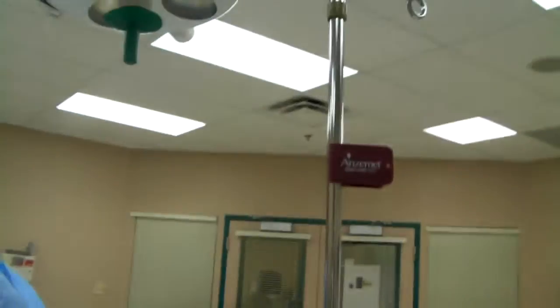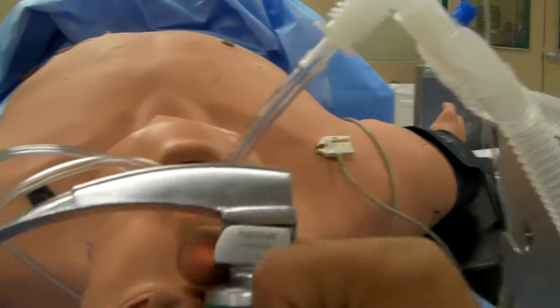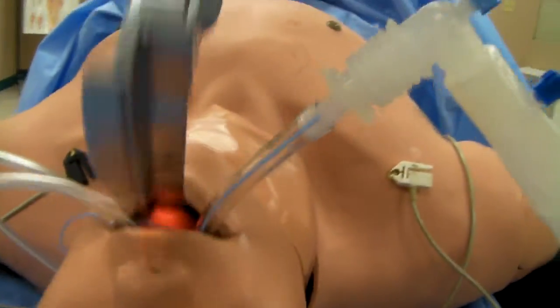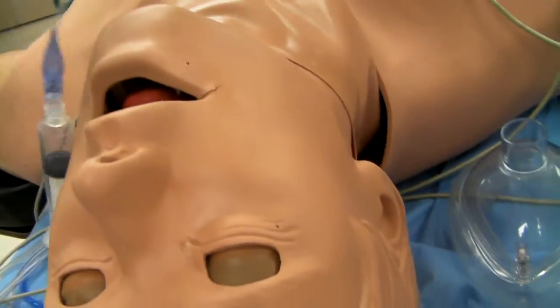Okay, so basically there's a light source right there, and you essentially stick this into the patient's mouth, when all of this is not in there.